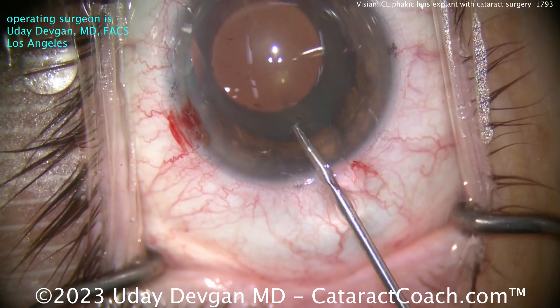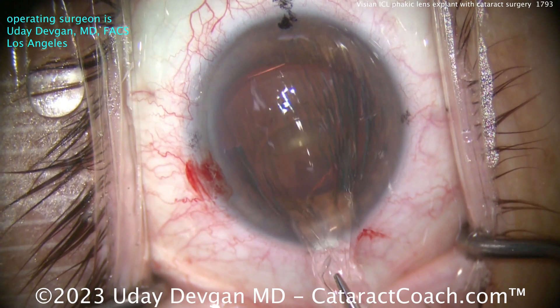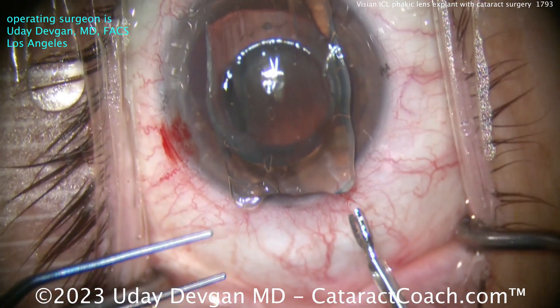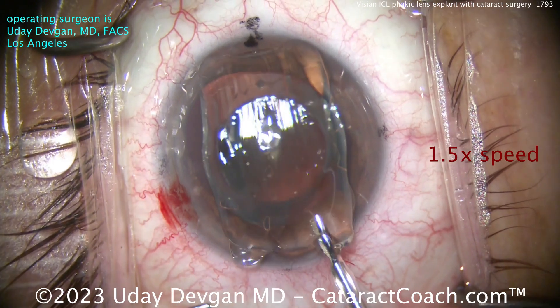Once you get that grasp, just retract and pull it out of the eye — you'll see it folds on itself. Place it on top of the cornea. Why place it there? To ensure that it's fully intact, that there are no broken off pieces stuck or left inside the eye. And that looks good.